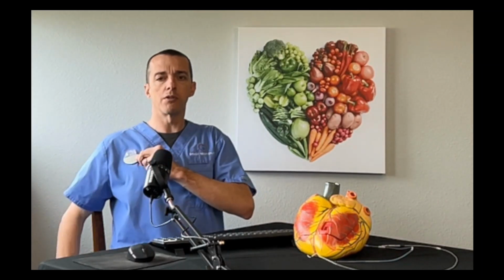There's going to be a bigger device, something like this. This is a pacemaker from one of the companies. This is not a real pacemaker, but it's a pretty good replica of what it would look like. It's going to be sitting usually over here in your left chest, somewhere in this general area. In a few people, we will put it over here on the right side, but that's pretty rare. Most people, it's going to be on your left side.